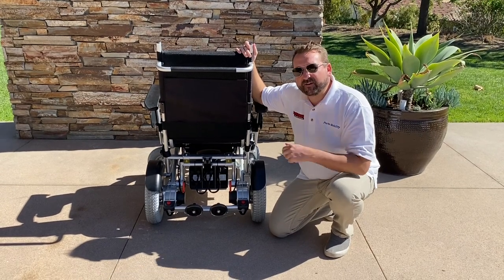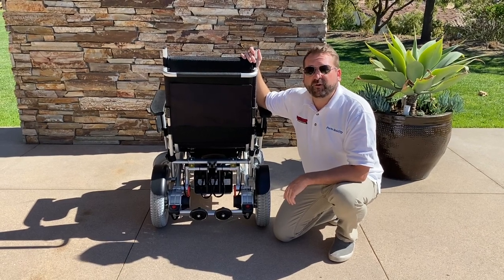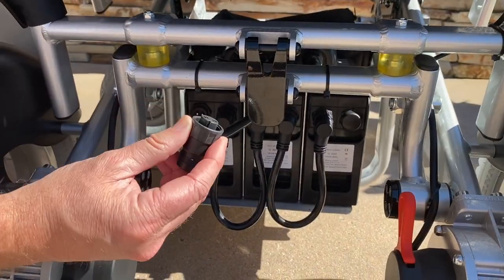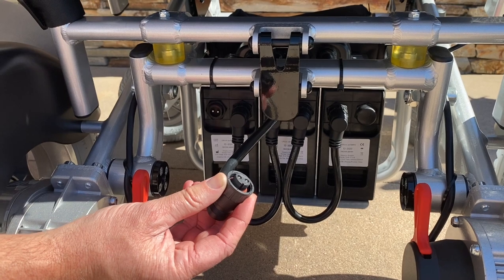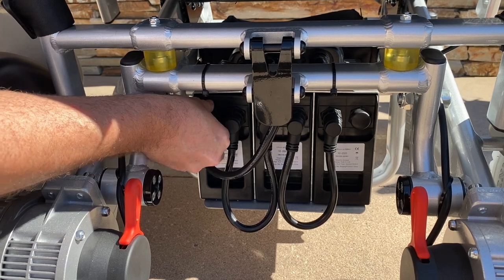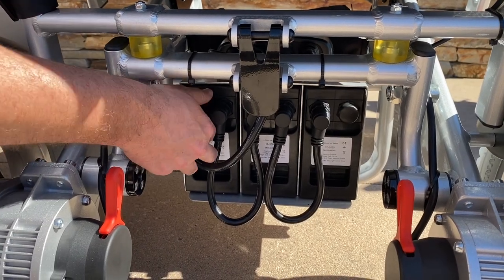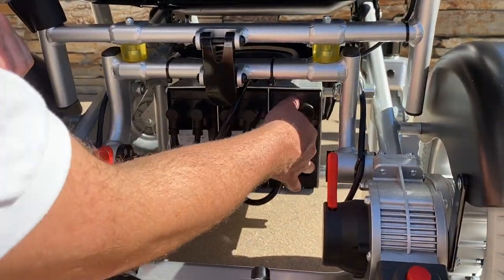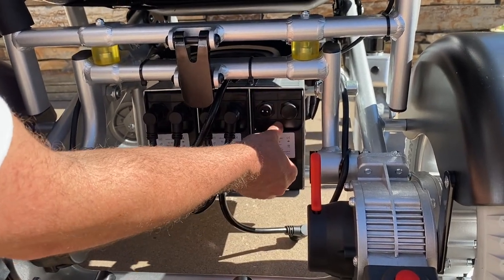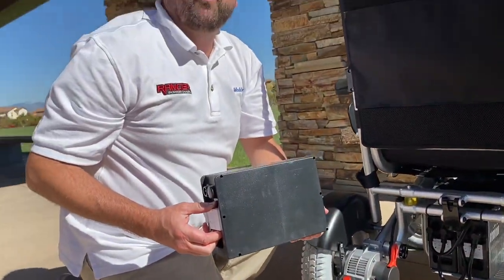The Beast comes with two batteries, which is good for up to 30 miles. However, you have the option of getting a third battery, which is good for up to 45 miles. If you choose that option, they're all already installed. To uninstall a battery, simply twist the cable and pull it out. Press the latch and bring the battery out. Each battery weighs about seven pounds.